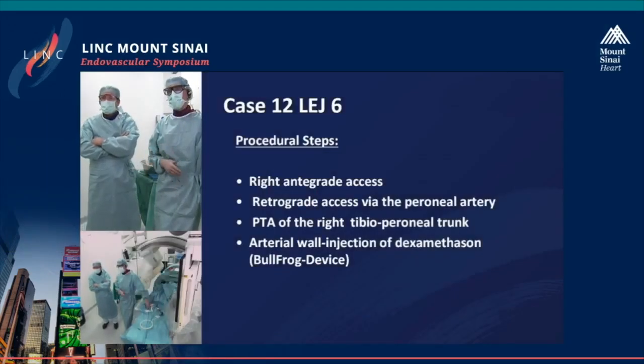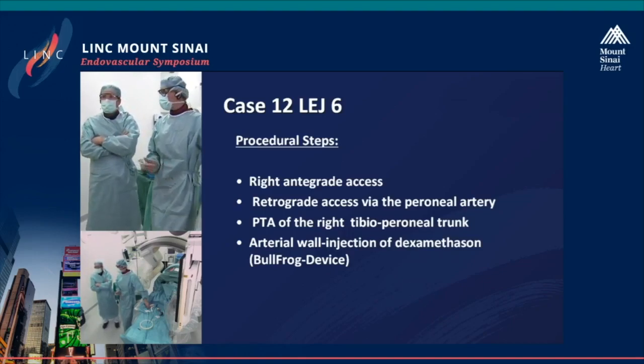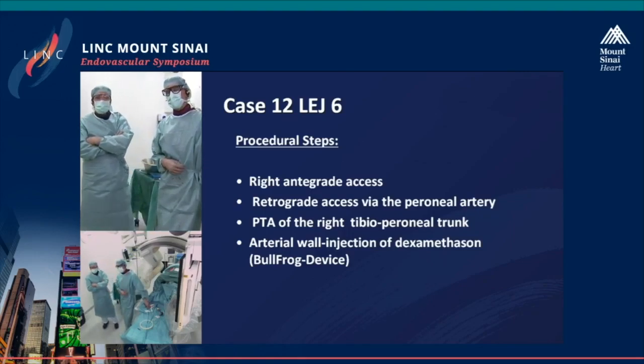So this is not the foot loop case, which will come later, the complex case, which Mansi will do for us. This is here now. Also a retrograde case, below the knee, actually completely below the knee, total occlusion, and maybe Sven, you can introduce the case. Yeah, thank you, Andre.